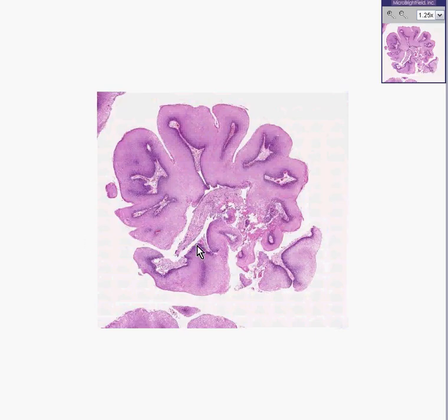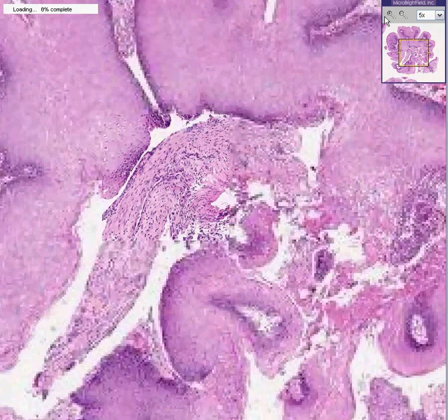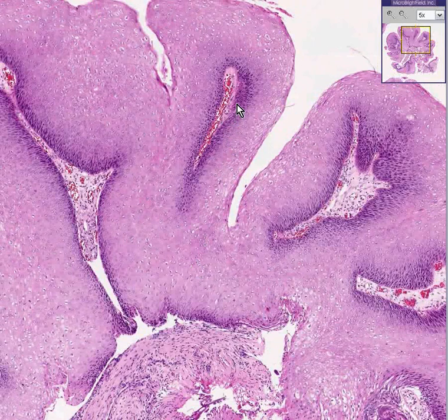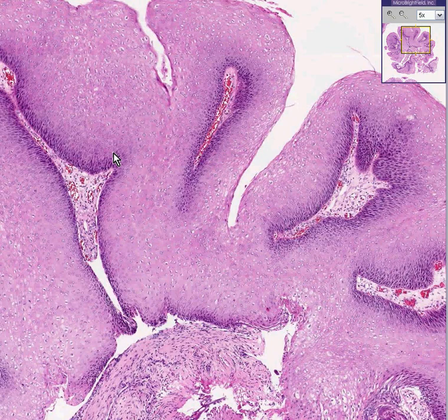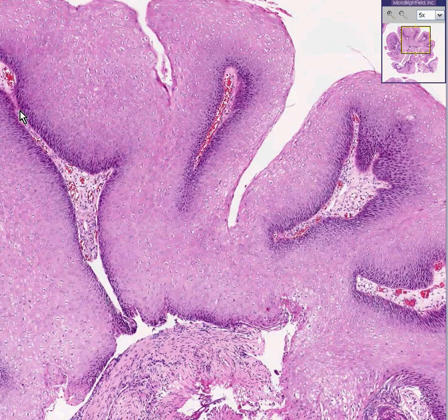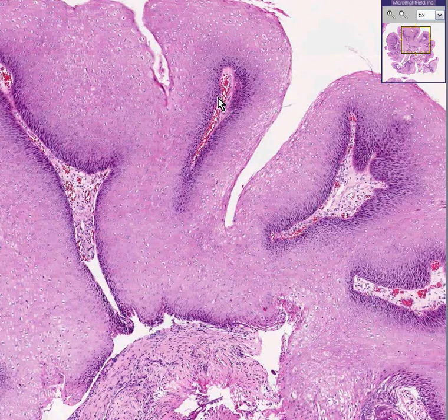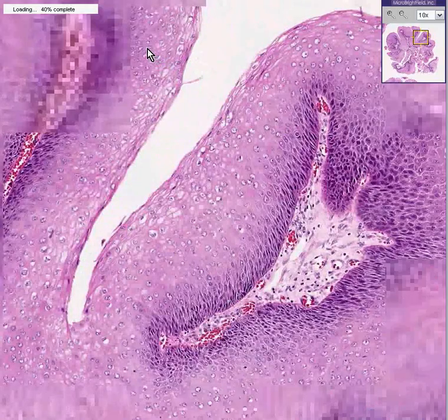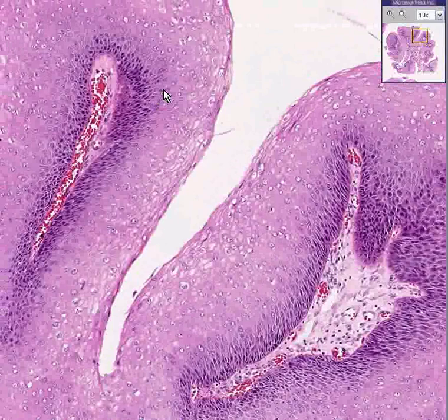I want to show you a microscopic picture. Like many warts, they look like papillary projections lined by squamous mucosa, and the squamous mucosa itself shows a normal maturation pattern going from the base to the superficial layer. Here's the central fibrovascular core, and here's another central fibrovascular core. Like other common skin viral warts, there are a lot of granules within some of these cells.